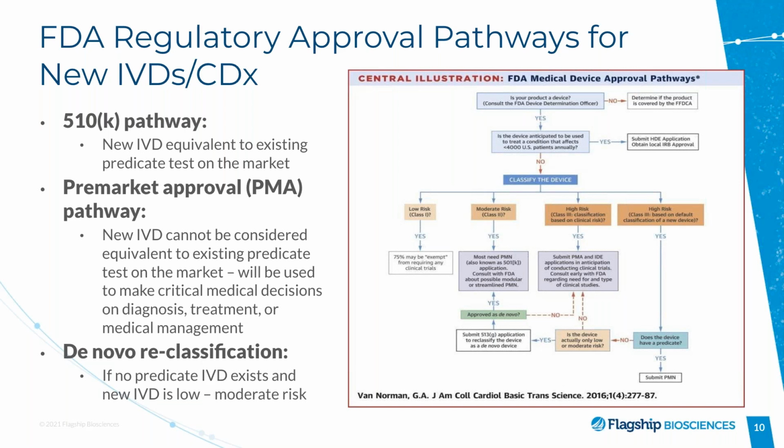The first reason has to do with the analytical part of the validation, right? So even in the situation where one is dealing with just one tumor indication, the heterogeneity within each indication can be so large that only utilizing a very large amount of specimens will yield a different type of morphology that will create a solution that can actually be useful in the real world. And that's the analytical reason.